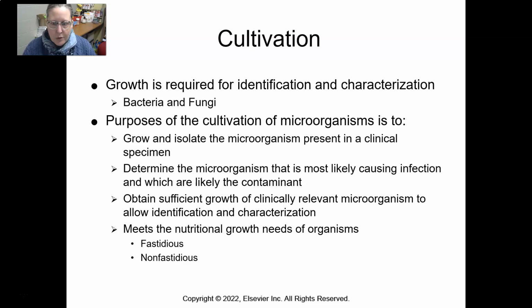You need to also be able to obtain sufficient growth of the clinically relevant microorganism, the one that's causing the infection or the problems, to then be able to go further with the tests of identifying and characterizing it, especially, for example, as far as antibiotic sensitivity, so that you know the right therapies to give to your patient.